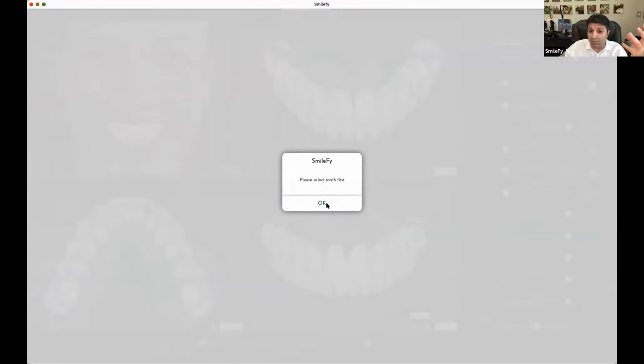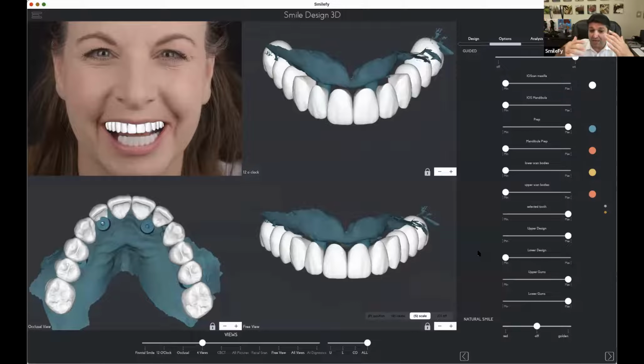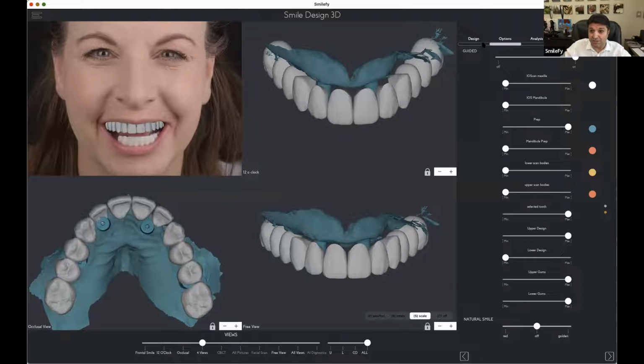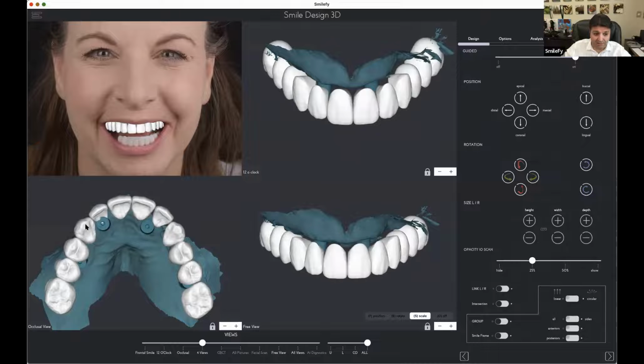One of the cases that inspired me actually to have all these options to be able to redefine the position of the occlusal plane was Scott McLean showed a case with a bridge design. Everything was good, everything was fine. The design was good, but then he analyzed the lip dynamics with the DSD protocol, right?